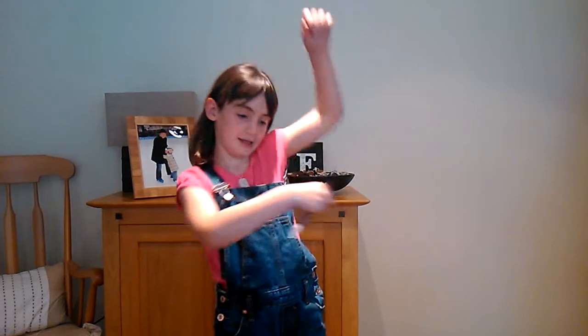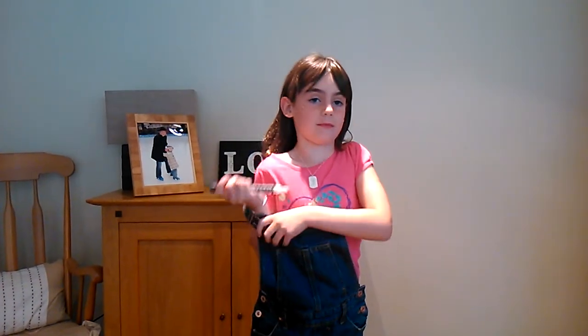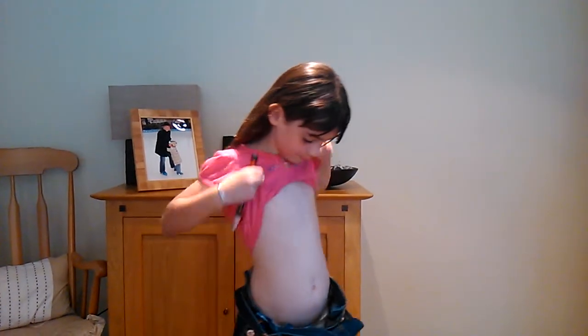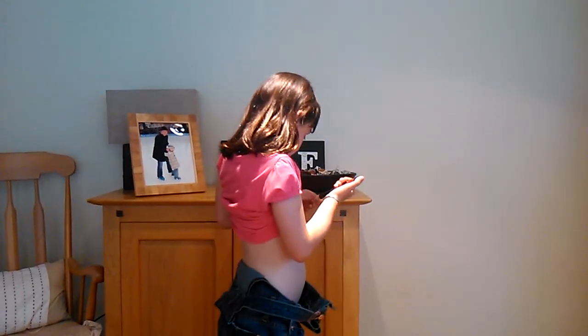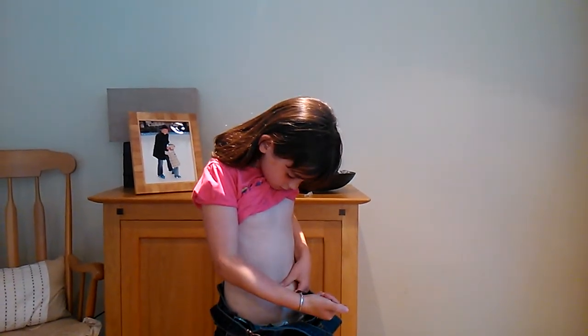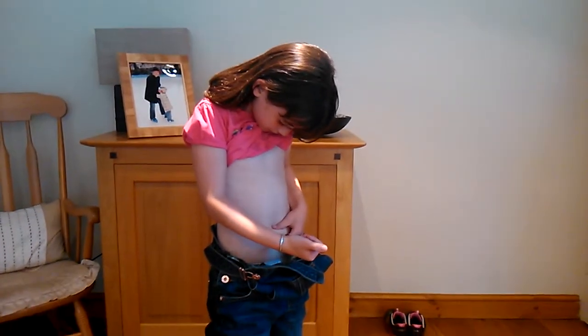Can you do it in your arm or do you want to do it in your tummy? Tummy. We're going to count to ten. Do you find a squidgy bit? Yeah, I found it because then it's easier for me.